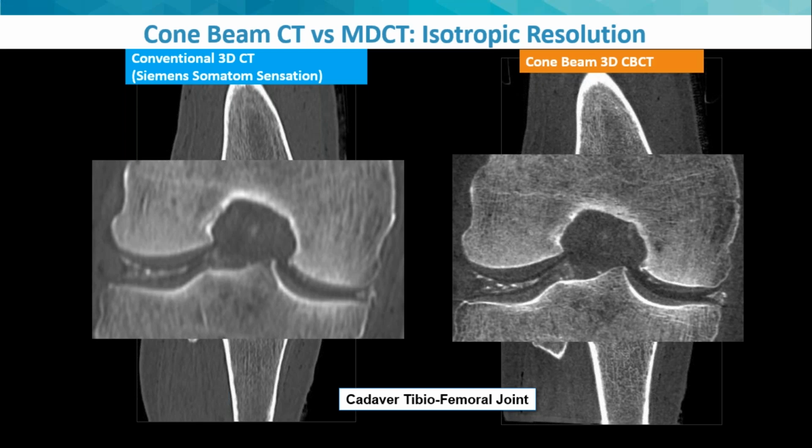The other aspect is that, I think because of legacy techniques that are used for traditional CT, the amount of radiation that is a typical protocol for a hand or a knee generates probably 2 or 3 times the amount of radiation incident on the patient than a typical protocol for a cone beam.